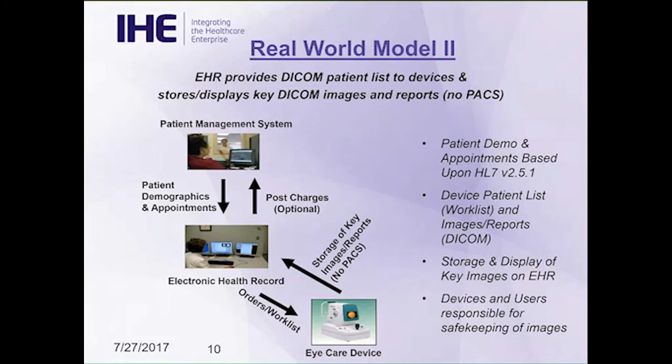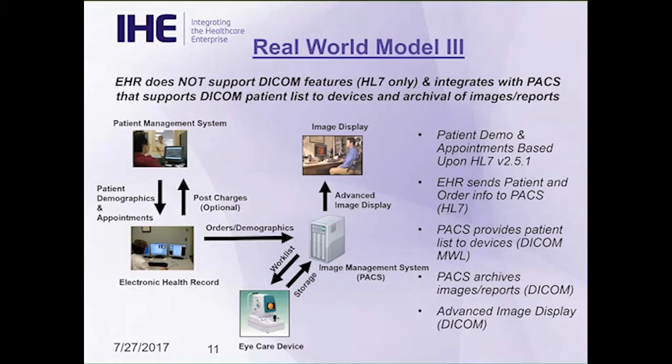And finally, you have real world model 3. Now the key part here is if you take a look at this first, you now have the same type of products that you had in Model 1. So you do have a PACS system, but the key difference is this. The electronic medical record does not support DICOM. So your EHR doesn't know how to do DICOM.